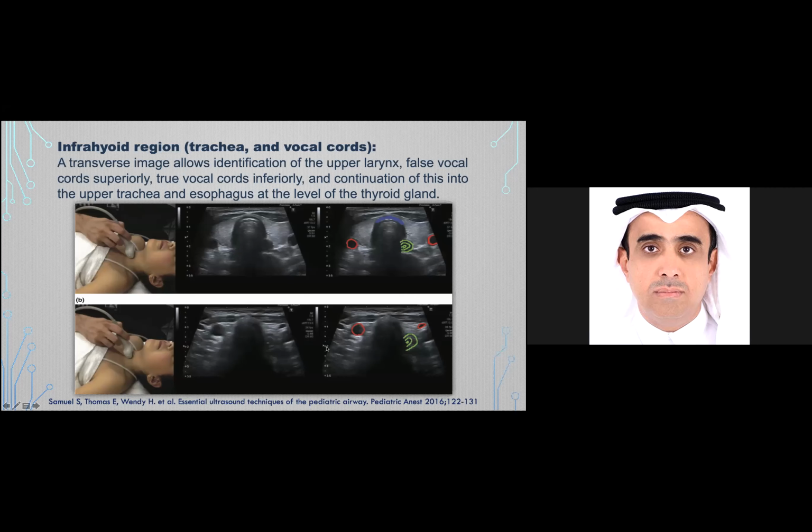The trachea, here marked in orange, is air filled, which makes it hypoechoic and therefore dark. So is cartilage, as you can see with the tracheal ring, which we here mark in red. As we move the probe in a cranial direction, we see a series of tracheal rings. And we now approach our first important anatomical landmark, the thyroid gland, here marked in purple. We can see both the lobes and the isthmus. This is very important to localize during a percutaneous tracheostomy in order to avoid injury.